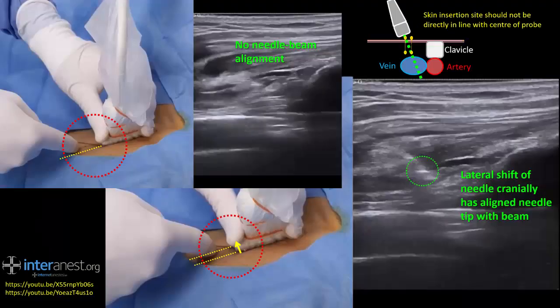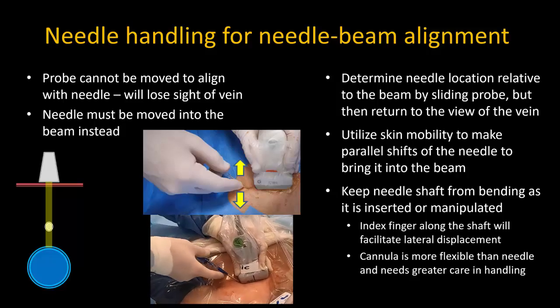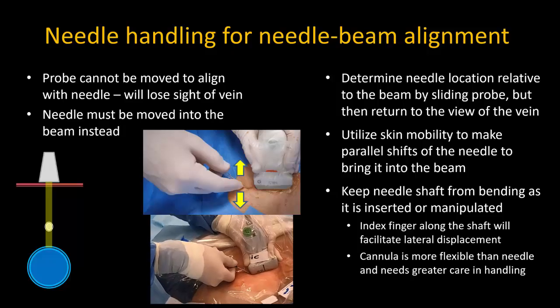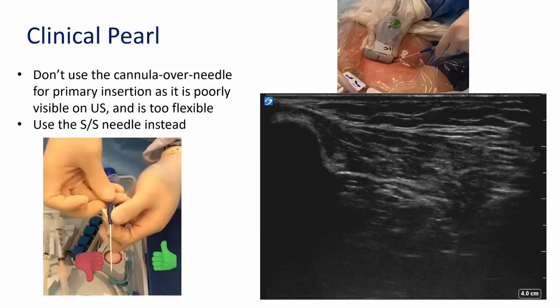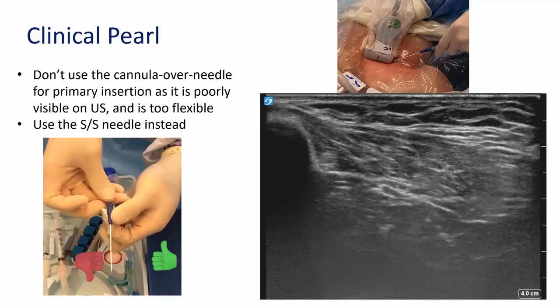These captured images illustrate the parallel shift process in more detail. Note that if the probe is slightly angled to visualize the vein, the skin insertion site should be offset from the center of the probe to compensate for the change in beam position at the actual depth of the vein. A useful tip is to place your index finger along the shaft to apply lateral pressure and shift it from side to side, and also to stop the shaft from bending — which will happen if you just manipulate it at the hub. The supplied cannula-over-needle in most sets is even more flexible and needs even greater care to avoid bending during insertion through tough cutaneous and subcutaneous tissues. I basically don't recommend using the cannula as your introducer needle — it's not rigid enough and is also poorly visible on ultrasound, as you can see here.